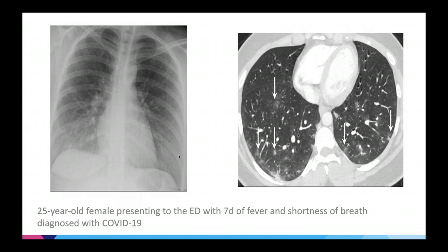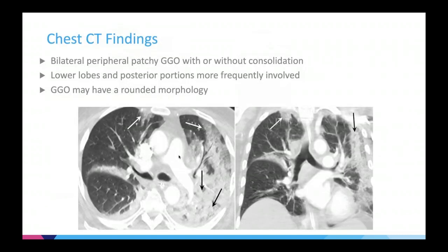This is another example: a 37-year-old male with fever, cough, and dyspnea for seven days, also due to COVID-19. You can see bilateral ground glass opacity that is rounded in appearance in both lungs, also highly suggestive of COVID-19 in the appropriate context.